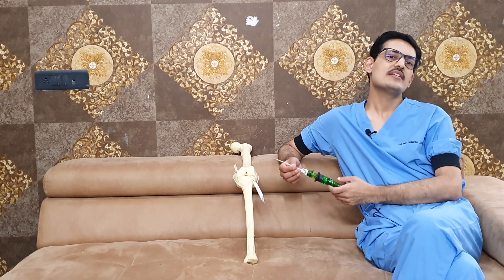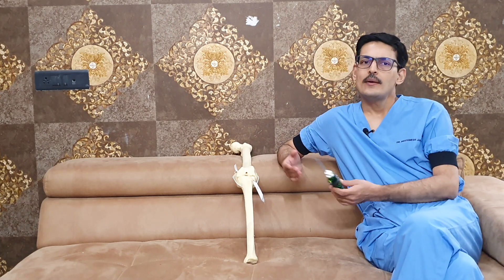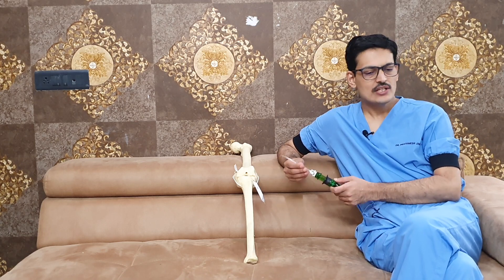Usually the straight device is more useful for the lateral meniscus and the curved device is more useful for the medial meniscus, but they can be used in a vice versa manner as well.